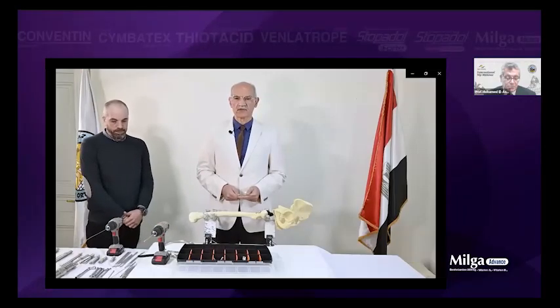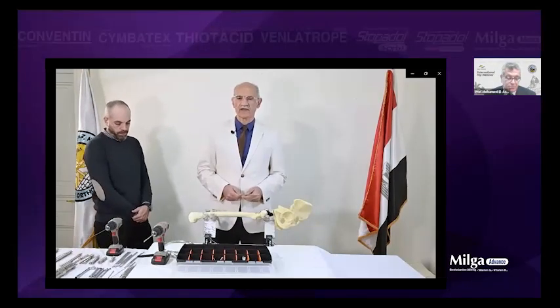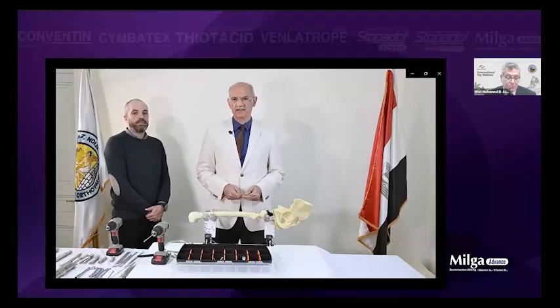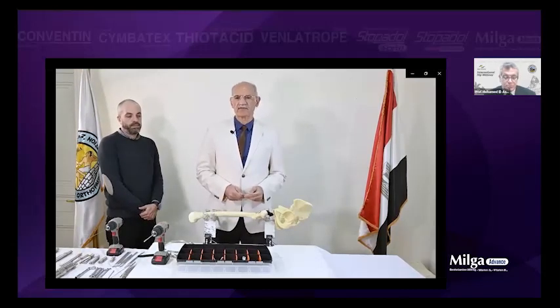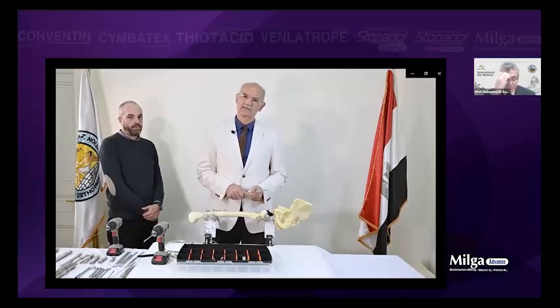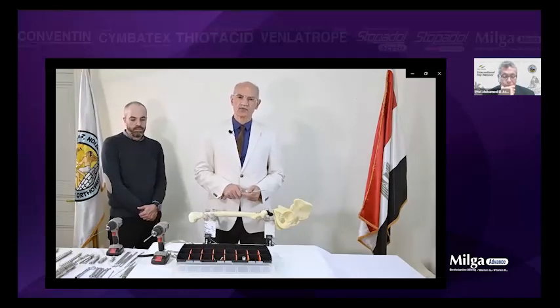Good afternoon, dear colleagues. Today I'm going to discuss how to fix the proximal femur by external fixation. The problem with fixation of the proximal femur, when you read the English literature, is that they always speak about the frame and how to have a fixed frame for each case. And this is the real problem, because if you have a fixed frame, it's very difficult to fix the proximal femur. Today I'm going to discuss how to fix it in the opposite way.